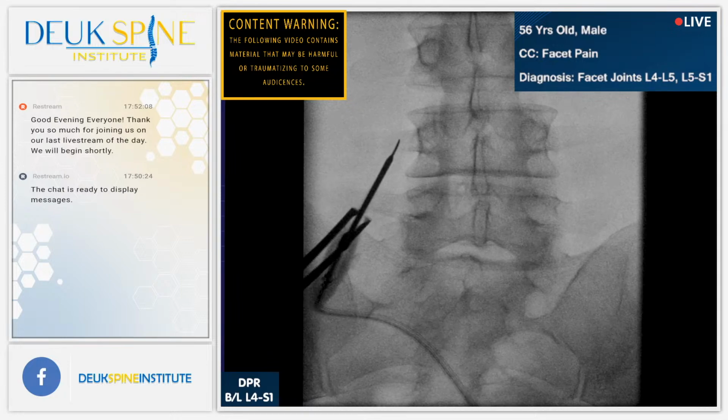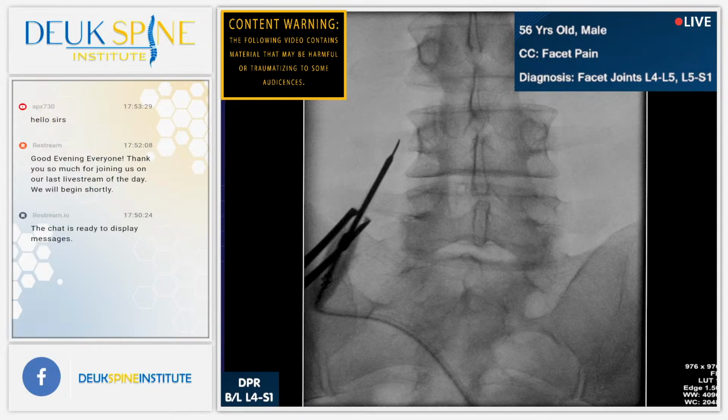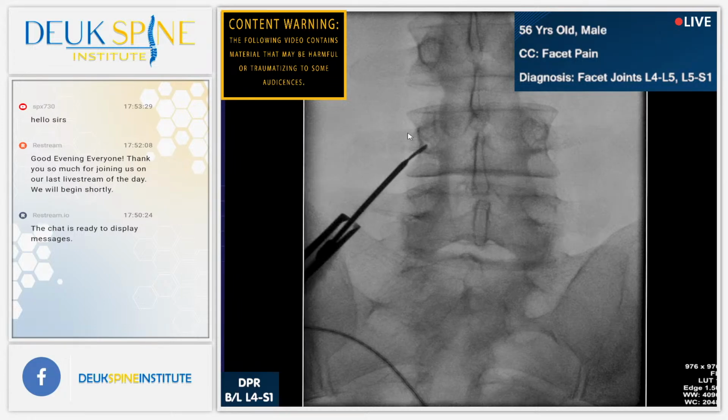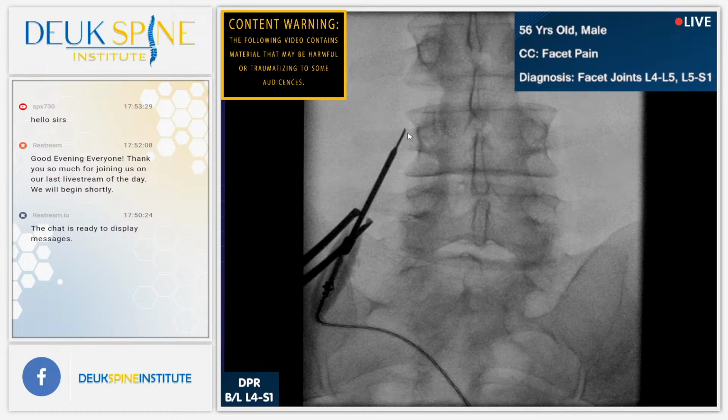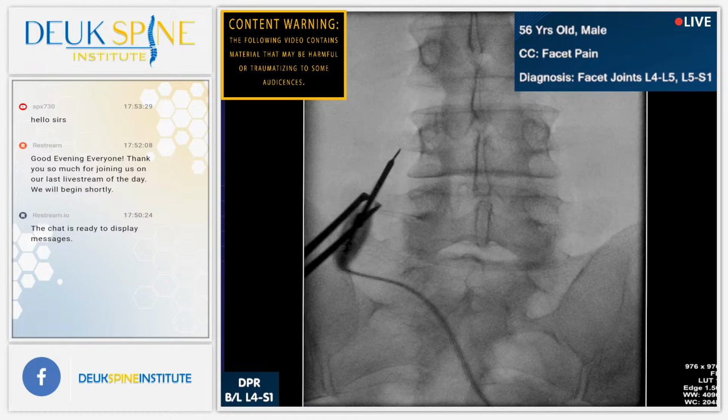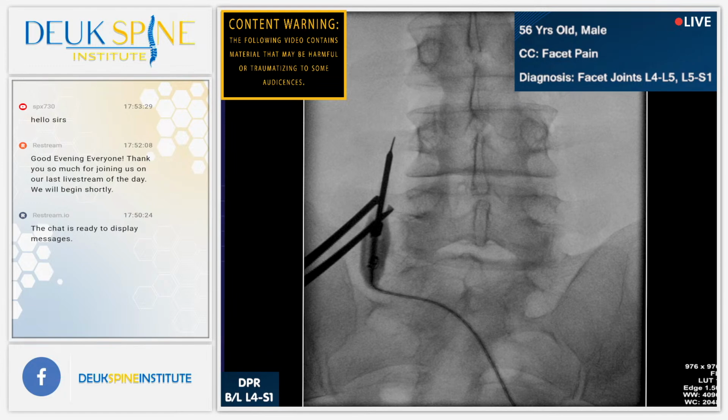Shot. I'm targeting the junction of the transverse process, superior facet, which is right where the arrow is. Yep, it's perfect. And once I get to this spot, I'm creating a burn right along the transverse process. Shot. And that's what a rhizotomy is. It's a burn. Shot.